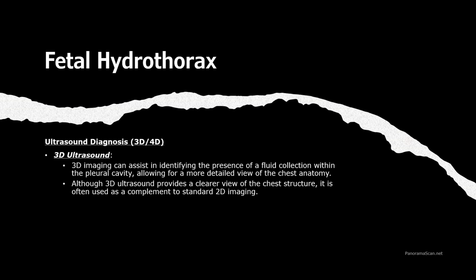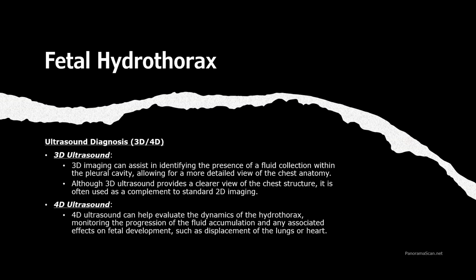It is typically used as a complement to standard 2D imaging, of course, which means that 2D remains the primary tool for diagnosis. 4D, on the other hand, allows us to assess the dynamics of the condition, where we can monitor the progression of fluid accumulation over time and observe any associated effects on fetal development.